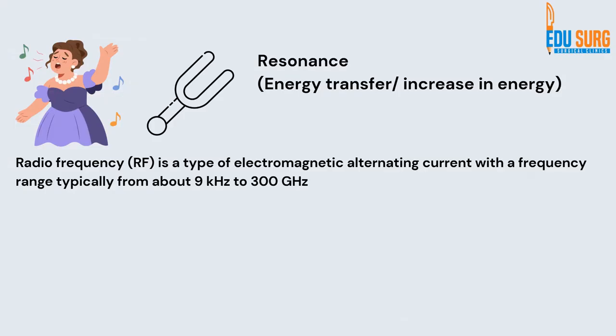So why is this important? This is important because the R of MRI is resonance. So if you understand what resonance is, apart from physics, it's frequency matching frequency, right? So if you connect to a person, you say my frequency matches with that person, suddenly the good hormones increase, you get excited. That is basically also resonance. You resonate with someone, right?